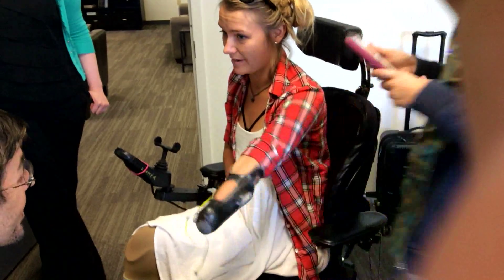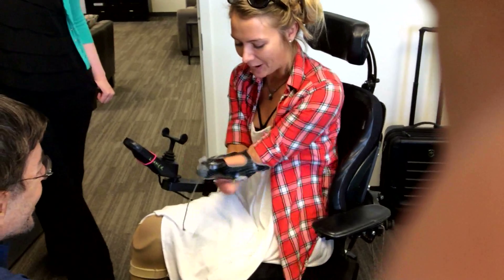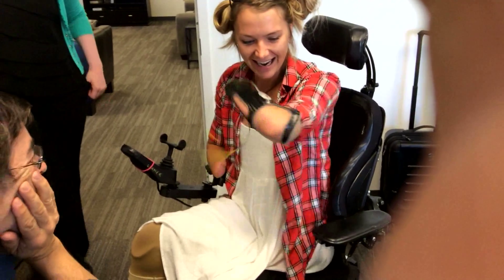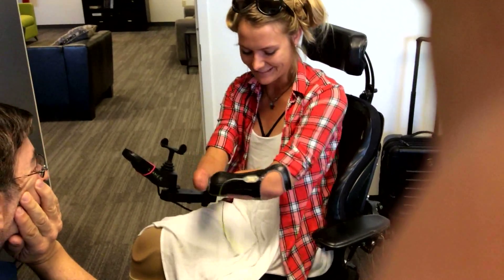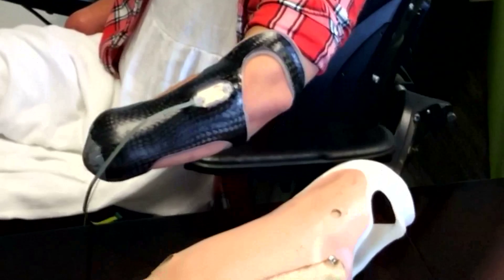A lot of motion — oh my gosh, this is crazy, it's like a part of my arm. Like a part of your arm, that's what I wanted to do. It is — oh my gosh, it fits like a glove. I'm amazed.